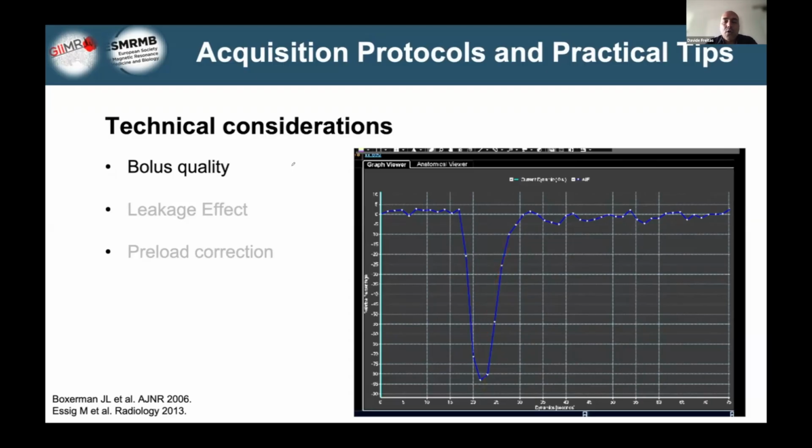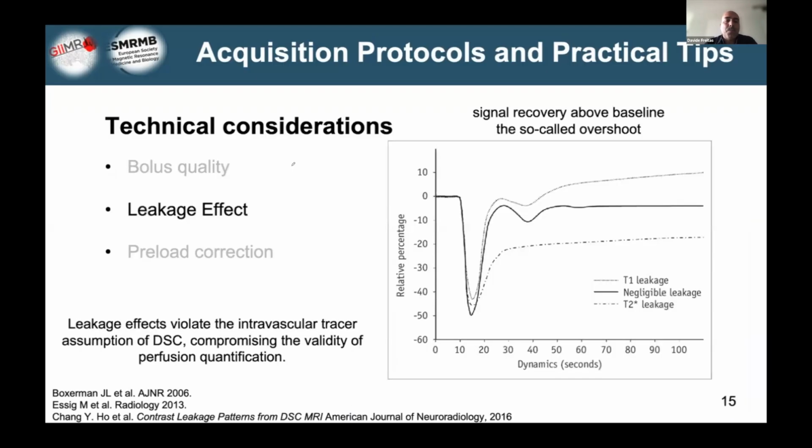excessive distortion or overshoots. One of the main challenges is leakage of contrast agent outside the vascular space, the leakage effect.